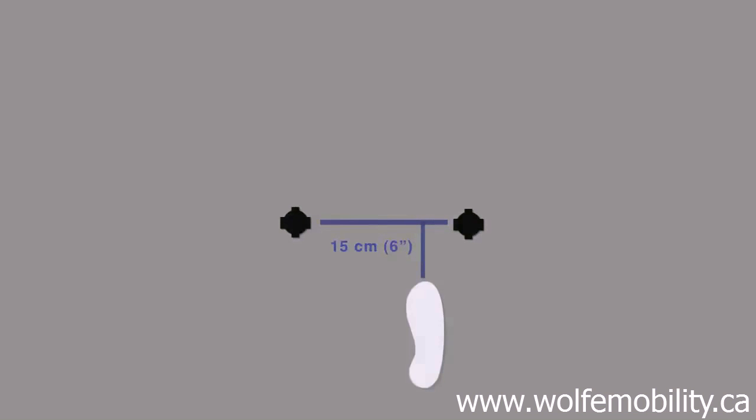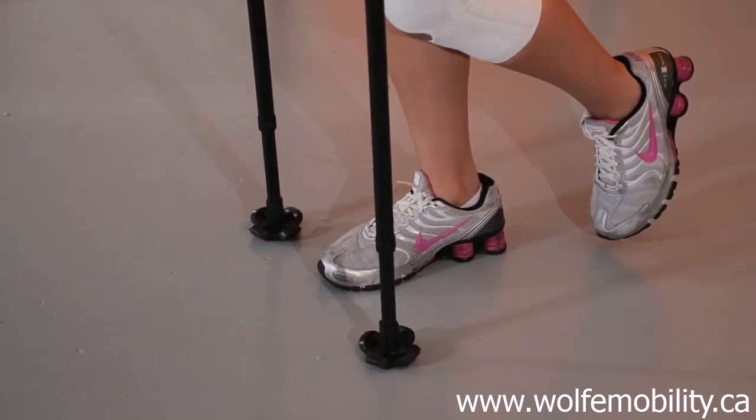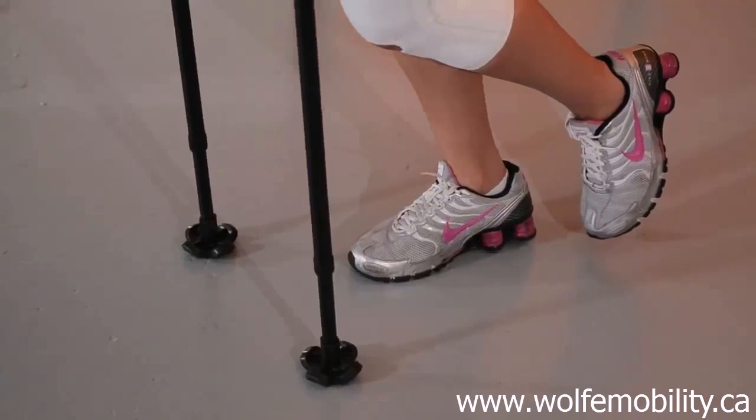Then, using both arms and placing body weight on both crutches, move forward with the good leg until it is standing parallel to the crutches. Do this very gently. Do not jump.